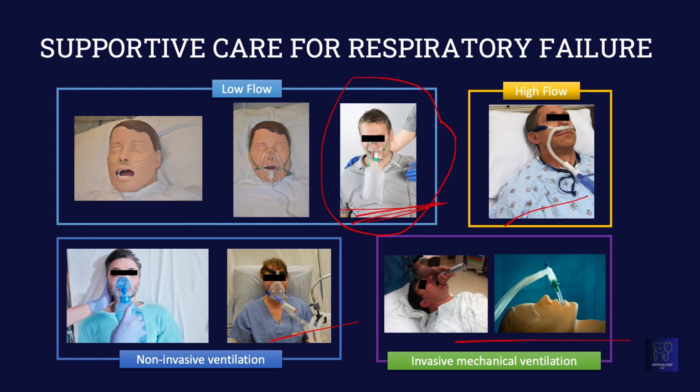And if it is too much support, let's say, a few minutes down the road, the patient is satting 100% and is not in any distress, then you can always downgrade the support. But what you don't want to do is start with a nasal cannula or a face mask and a few minutes later see that it's still not enough, then go up on the support. You're wasting precious minutes there. So that's why a non-rebreather mask in situations like this is a good starting point.